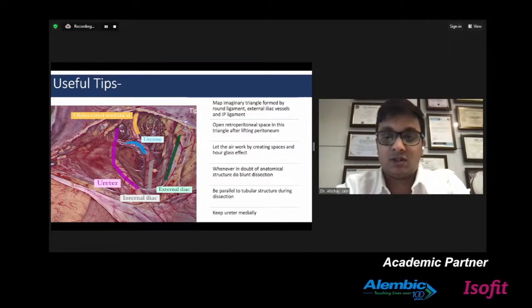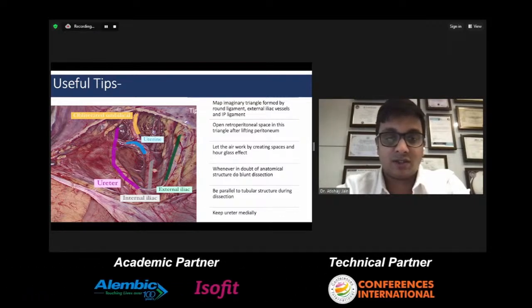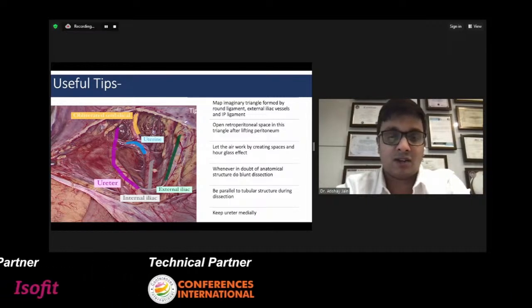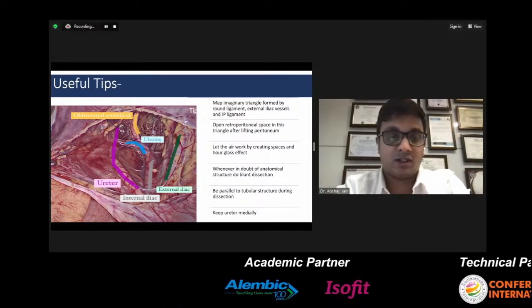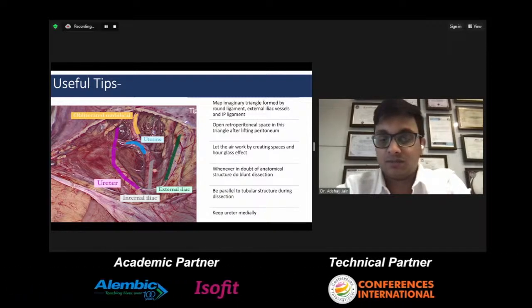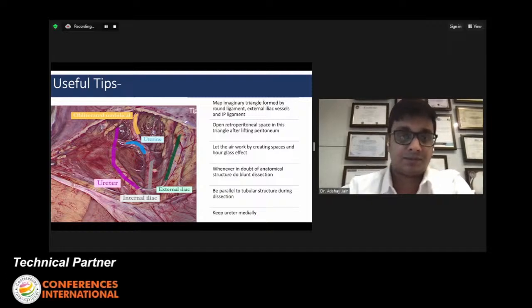And whenever in doubt, you should do blunt dissection rather than just cutting the structures, because you might just cut some important vascular structure. And always be parallel to the tubular structures like the ureter. So firstly identify the ureter and then go lateral to it, and always keep the ureter medially.